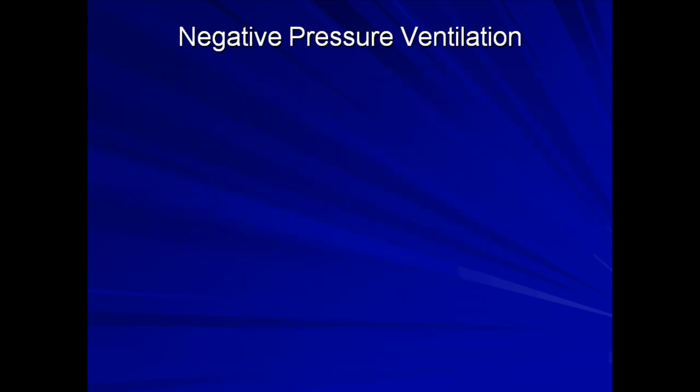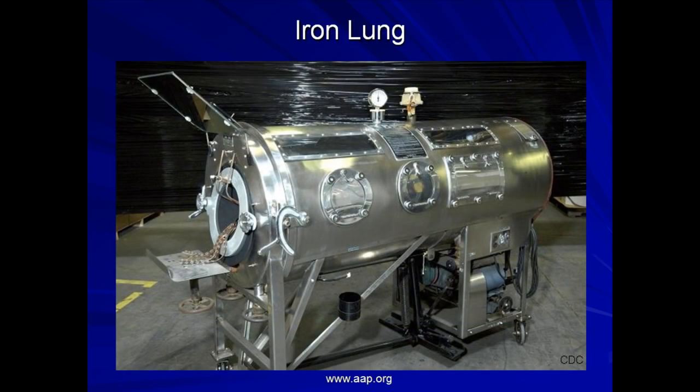The first negative pressure ventilator to enter clinical use was invented by two Harvard professors in 1928. It was initially called the Drinker respirator after one of the inventors, but quickly became known as the iron lung. Here's a picture of it. The patient's body would lie supine in the tube with their head sticking out of the hole at the top, resting on that comfortable looking metal tray. You can see a mirror above where the head would lie, which would be what the patient used to look at their care providers and visitors, since they couldn't move themselves.